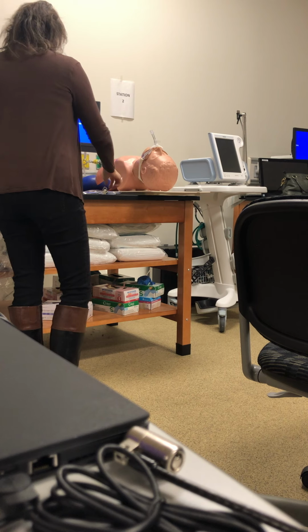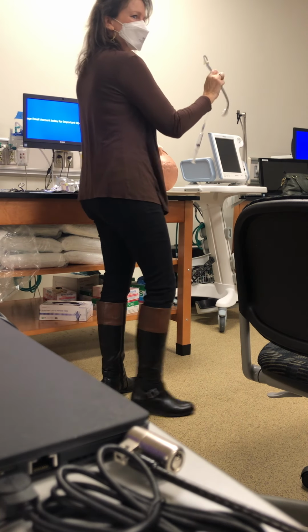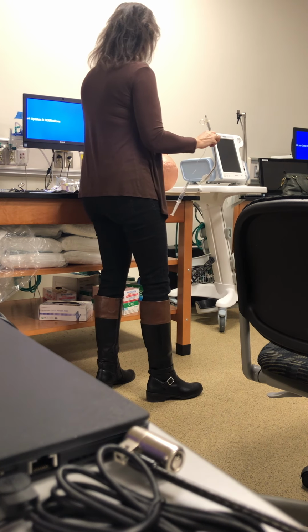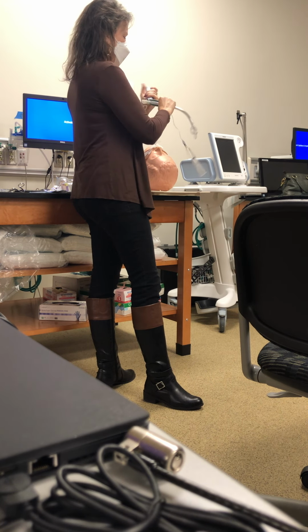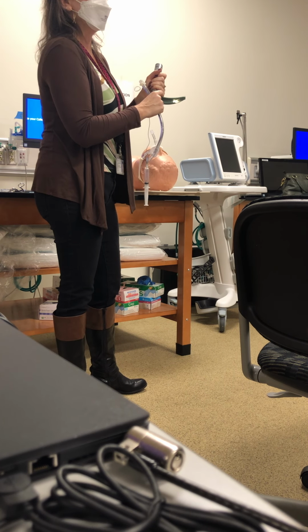Macintosh. So we got our Macintosh ready. We have our tube ready. So whoever's assisting you is going to be holding the tube, okay? So when you put the blade into the back of the throat, depending on this type of blade, if you have a Macintosh, it fits into the vallecula.